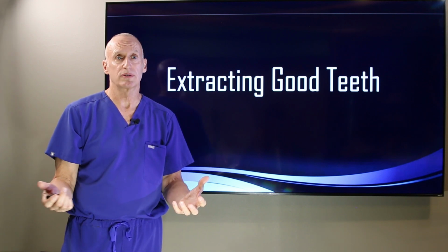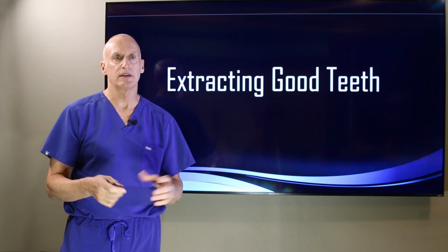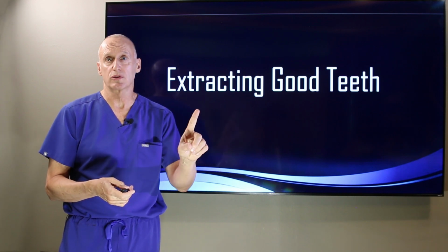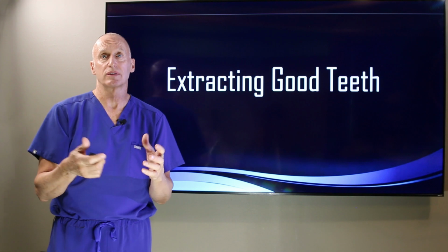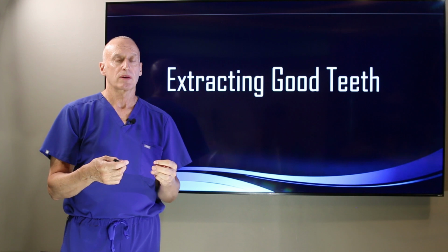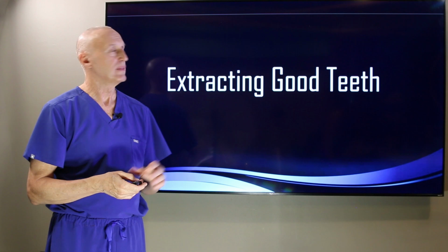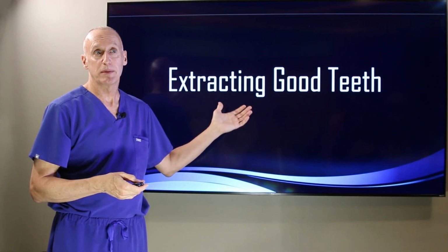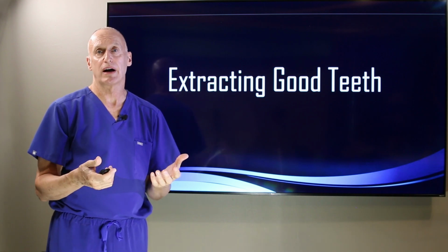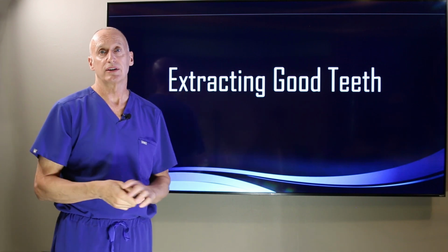If you can do it more than once, and some of our patients can, then I say, sure, we'll be conservative and work around your good teeth, and maybe over the next 10 or 20 years, we only have to address 1 tooth at a time with a single tooth implant, or maybe 2 or 3 teeth at a time with a 2 or 3 tooth bridge. There are certainly ways that we can take this in steps. So I'm simply going to say that yes, it's happening. People are taking out good teeth, and I think it's all about full disclosure. That's something that should be decided between your doctor and yourself.